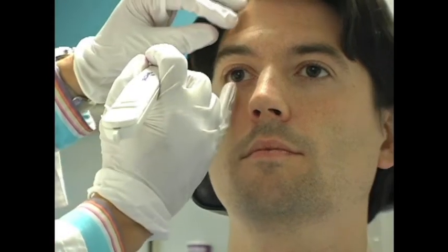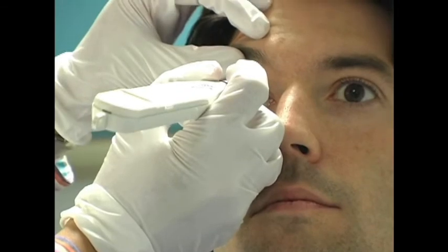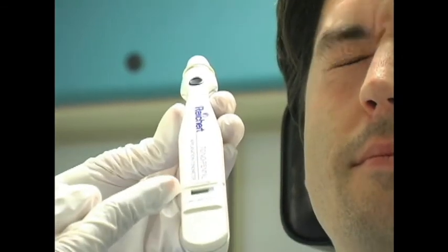Have the patient focus with a non-tested eye on a distant object, such as a visual acuity chart, a doorknob, or a light switch. Next, lightly tap the center of the cornea several times. You will hear clicking while you are tapping. Continue tapping until you hear a beep, then record the pressure from the LCD screen.